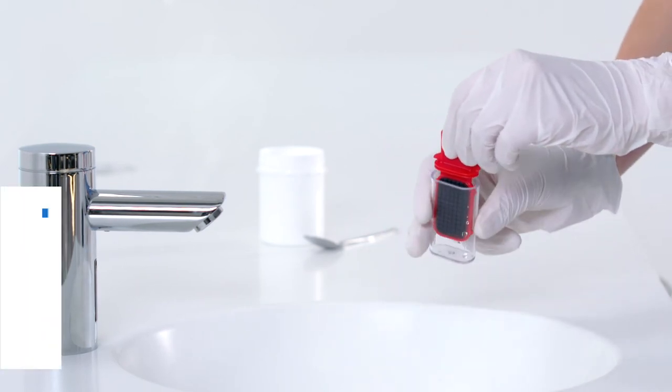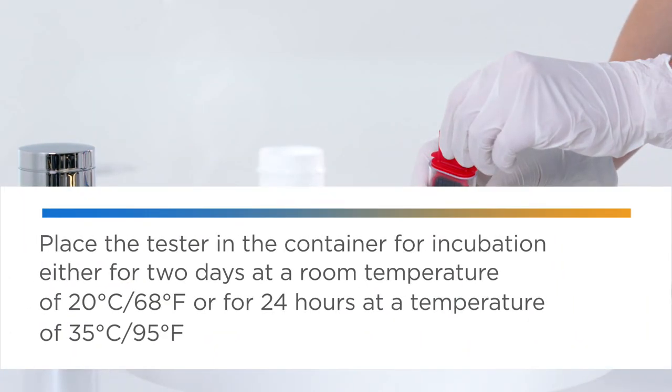Then empty the container. The result of the test provides information on the hygienic condition of the water.